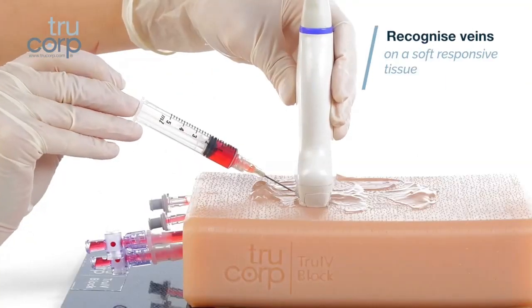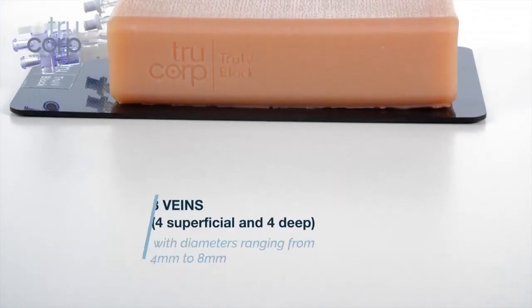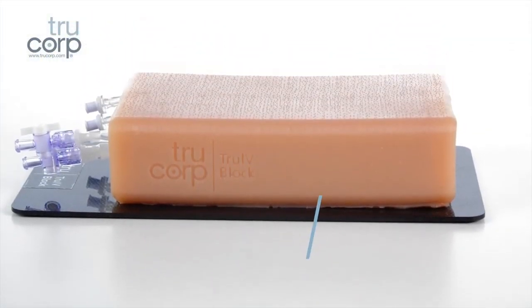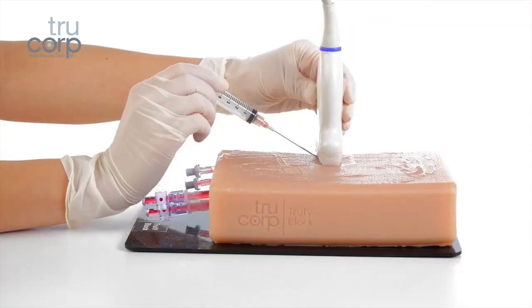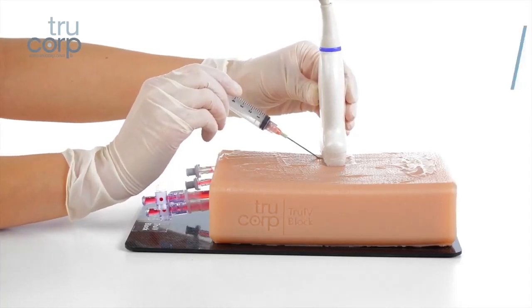On a soft responsive tissue featuring eight veins with diameters ranging from four millimeters to eight millimeters. Four of the veins are superficial and four are deep. For lifelike training, fascia layers are also featured for enhanced realism.